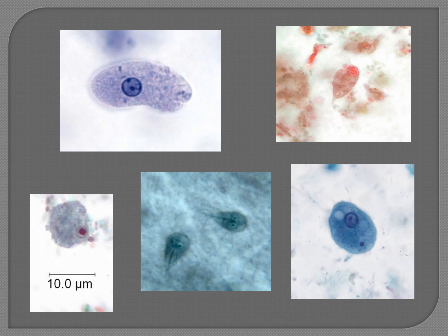In the upper right image, we have a Chilomastix. You can see that it's kind of stretched out and pointing at the posterior, and that the nucleus has gone to the anterior. The reason it's shaped like that is because of its torpedo-like motility. The image on the bottom left is an Endolimax nana troph, and you can tell that it's an E. nana troph because it has a very large karyosome. They call that the lump of coal karyosome. And you can see the nuclear membrane, but the nuclear membrane has no peripheral chromatin.